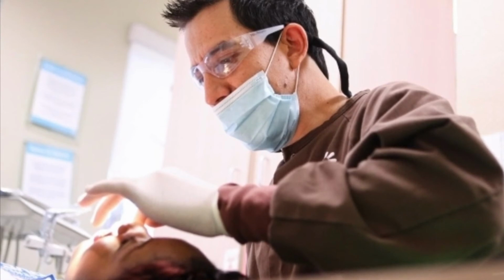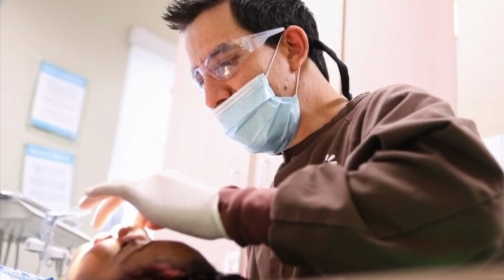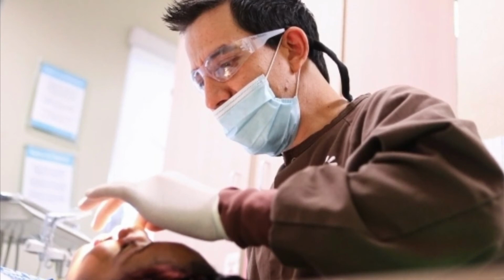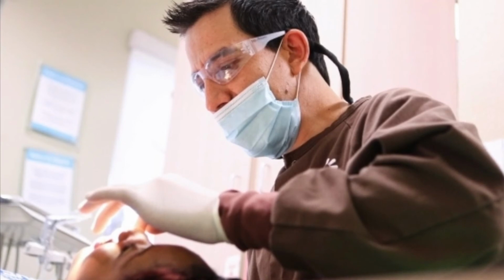So CBCT offers relatively high resolution isotropic images, allowing effective evaluation of root canal morphology and other subtle changes within the root canal system. It is faster and lower cost compared with MDCT. It is a high contrast imaging modality that could capture the information in 3 dimensions using a limited field of view.